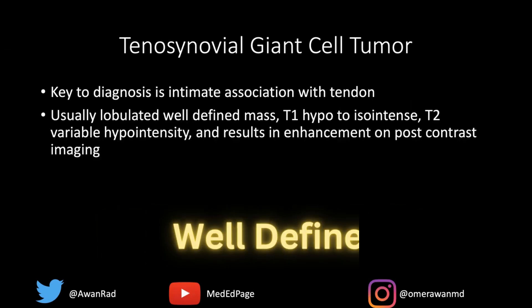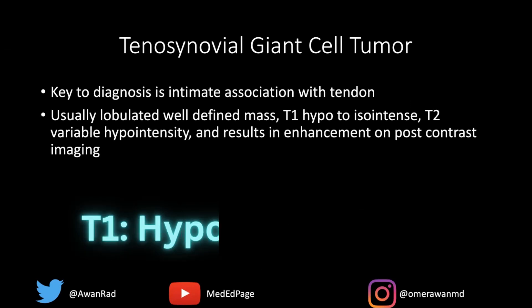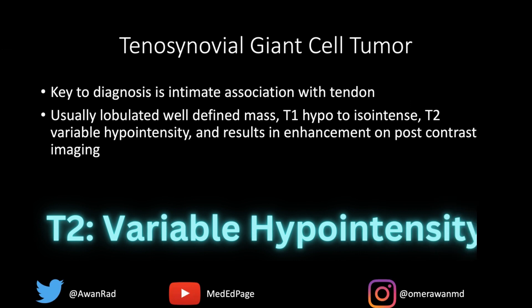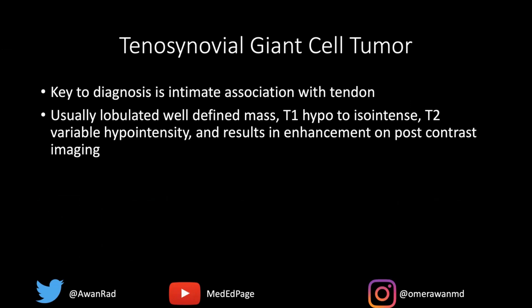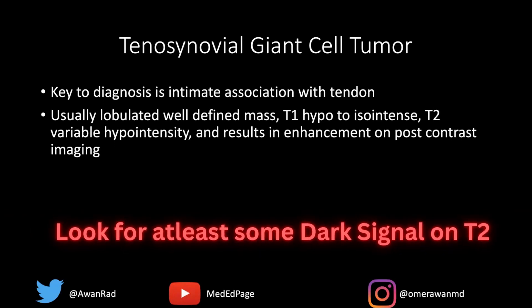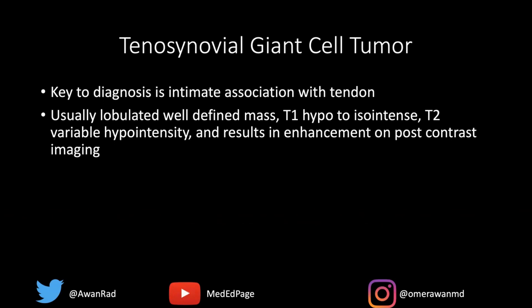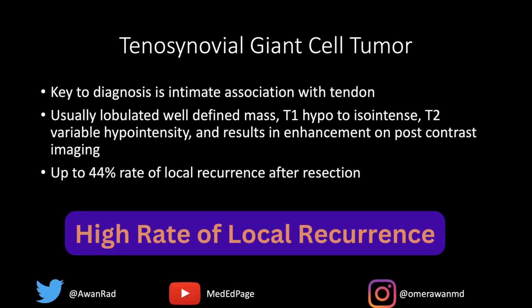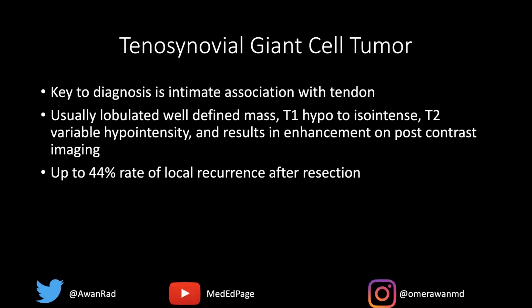Typically on MRI, it's well-defined and will be dark — isointense to muscle or hypointense — on T1. On T2, signal can be very variable, ranging from hypointense to even brighter than muscle, but there's often some dark signal as in our index case, because that represents hemosiderin or fibrous tissue. Look for even a trace amount of dark signal on T2. These typically enhance on post-contrast imaging. It's important to note that after resection, they have a high rate of local recurrence — up to 44%.